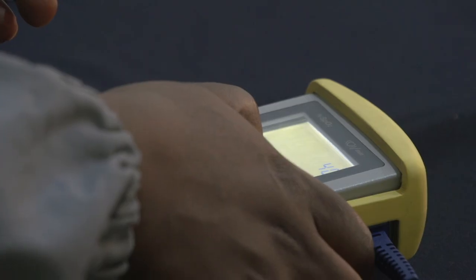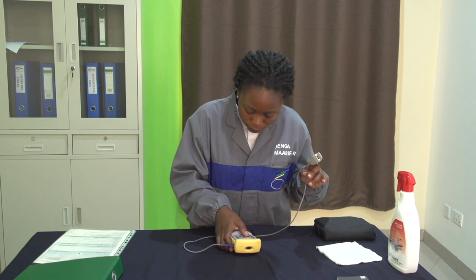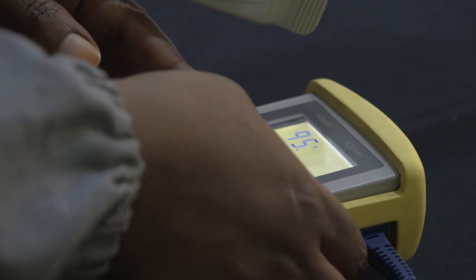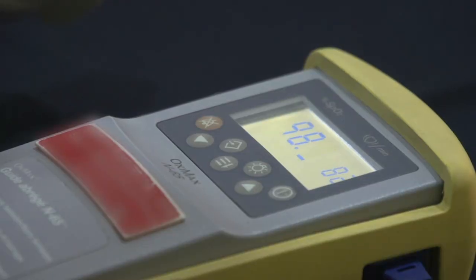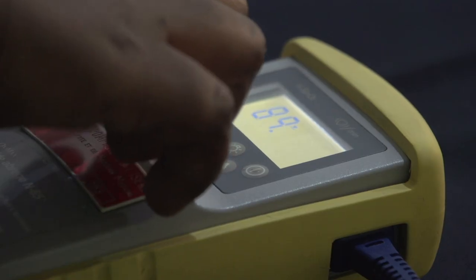Ensuite, on va vérifier le fonctionnement de l'alarme de désaturation. Pour cela, on va aller dans les réglages d'alarme et régler le seuil bas de l'alarme de SpO2 à une valeur supérieure à notre propre valeur de SpO2, et on vérifie le déclenchement de l'alarme de désaturation. Attention, on n'oublie pas de remettre le seuil d'alarme tel qu'il était à l'origine.